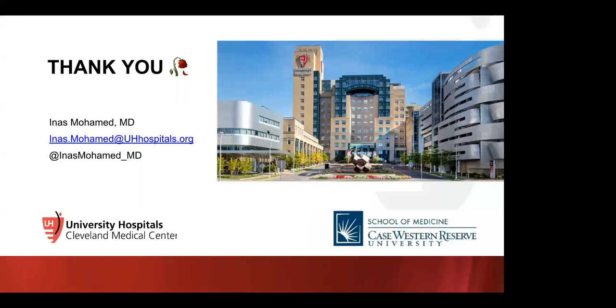LIRADS. What about LIRADS? We don't use LIRADS a lot in Egypt. We generally tend to describe the lesions as we see them in the CT or MRI, and we don't give them a LIRADS category.